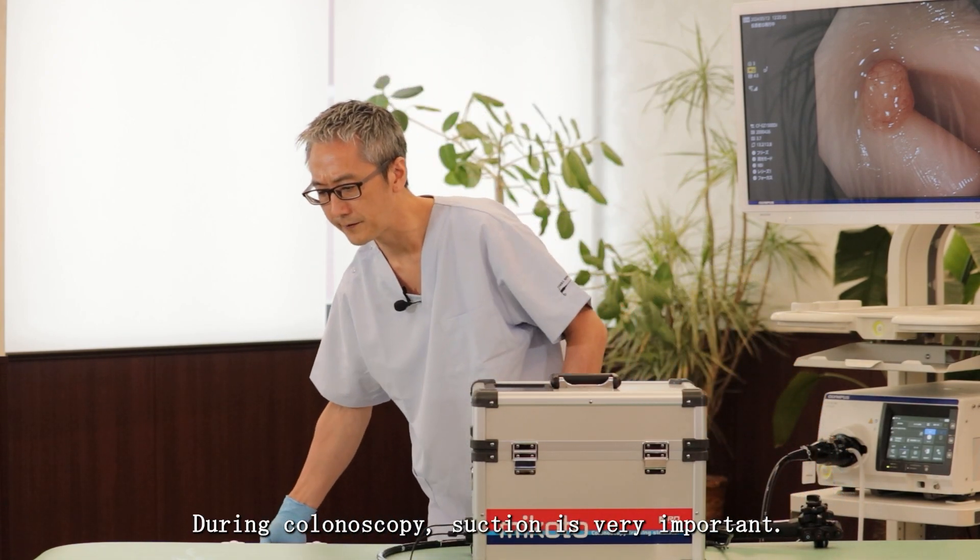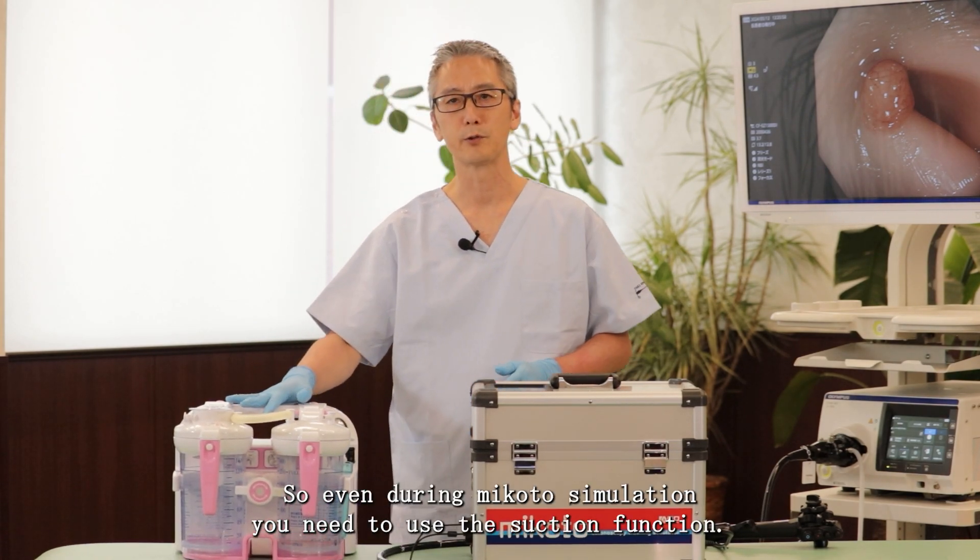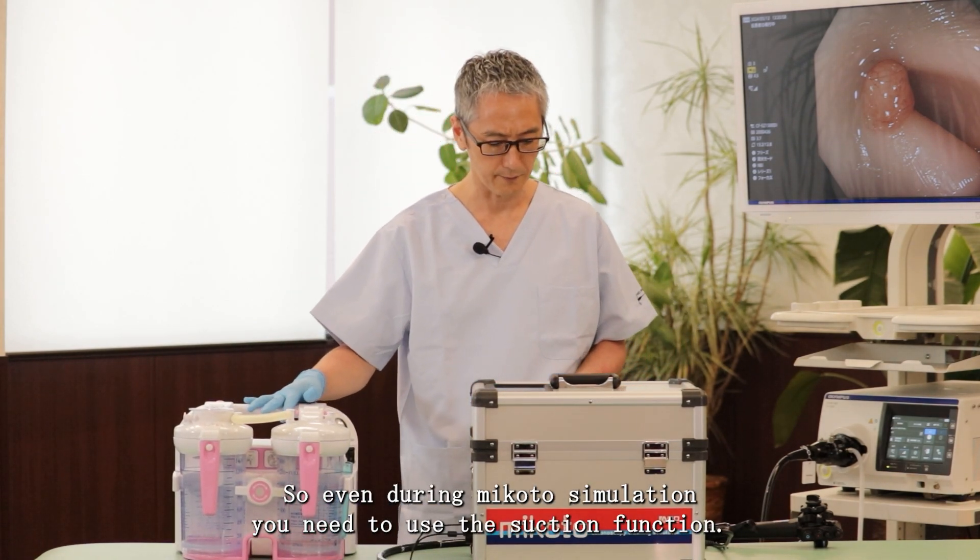During colonoscopy, suction is very important. So even during Mikoto simulation you need to use the suction function.